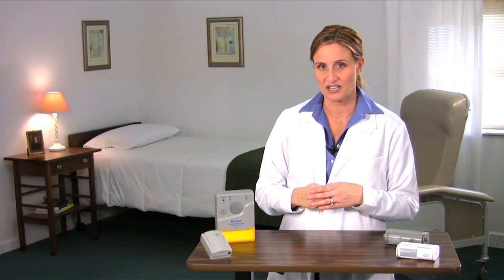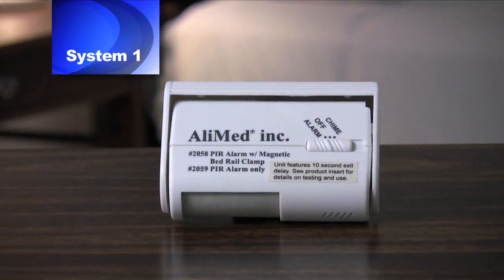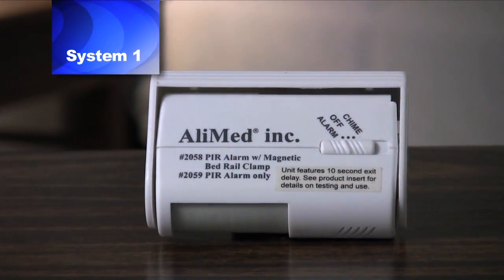The PIR alarm system is available in four different configurations. Here we'll quickly overview each. For detailed instruction on how to use and set up, please see the appropriate video. System 1 includes a self-contained alarm sensor unit that sounds at bedside only. When activated, the alarm sounds for 30 seconds before automatically resetting itself. As long as there is motion in the sensing field, however, the alarm will continue to sound.